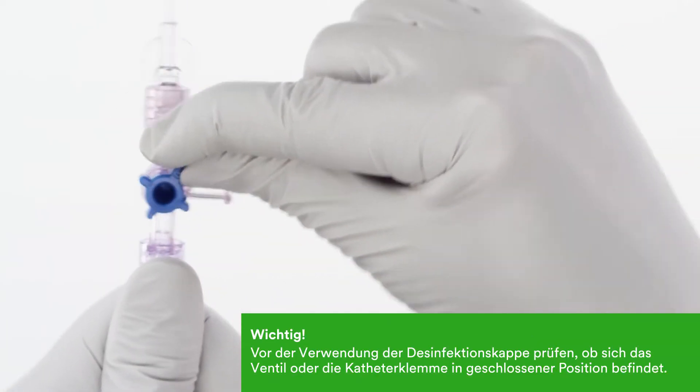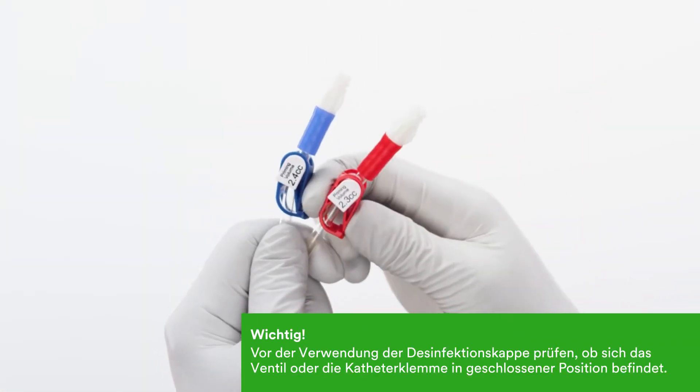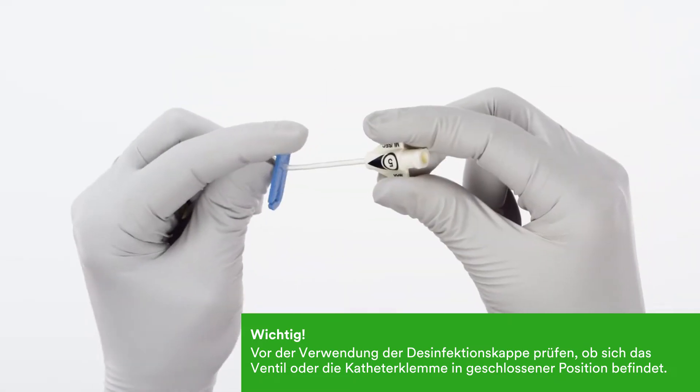It is important to verify the stopcock valve or catheter clamps are in the closed position prior to using the disinfecting caps.